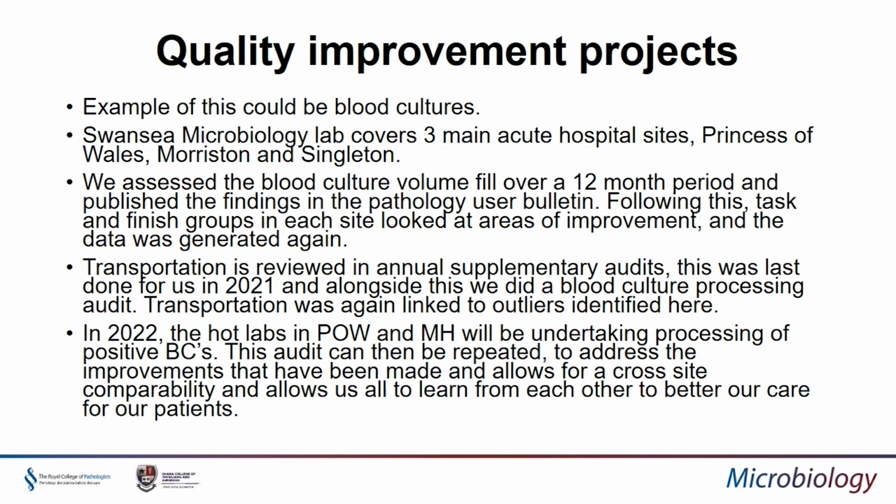It'll also show that these samples will be transported to the lab quicker. They'll therefore be able to be incubated quicker, and any positive blood cultures that we have will likely get to us quicker as well. All of these things can be addressed by repeating these audits, and it's quite a nice little quality improvement project that has quite a good clinical outcome for all sites. We haven't gone live yet with the blood cultures, so this is going to be in the next few months. It's going to be a busy time, but I think it'll be a really good project to get behind and see what data we generate.